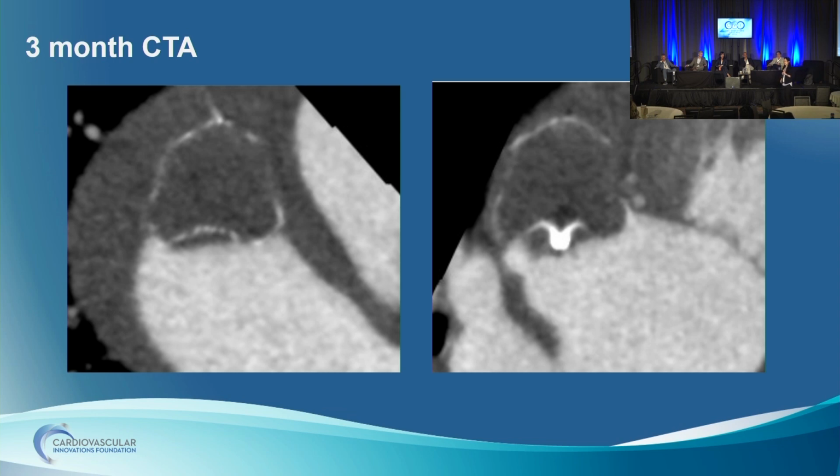So Jason brought up a good point. When we see this sometimes, we don't call it clot. We sometimes say that this is aggressive endothelialization. It could be clot behind the fabric. What if you got this image at your 45-day CTA? What if this was your initial image? Even if the patient were on DAPT and I got a CT at 3 months post-DAPT and it looked like this, I probably wouldn't escalate. I would just continue the DAPT. It doesn't look high risk to me.